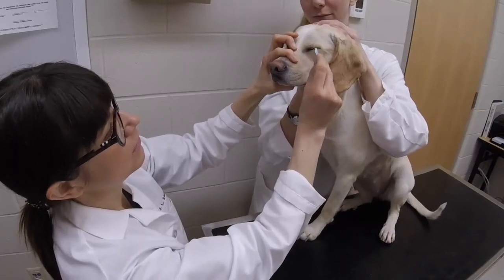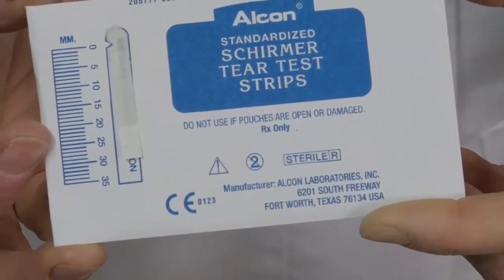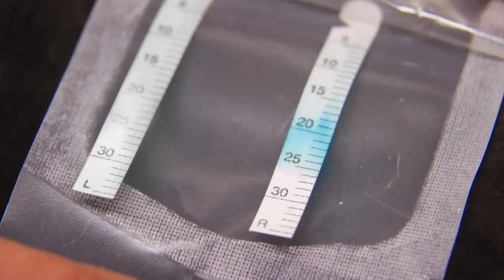After 60 seconds, the strip is removed and immediately placed on the measuring gauge provided on the original package to measure the amount of wetting in millimeters. Schirmer tear test strips are also available that are impregnated with a blue dye that marks tear migration in millimeters directly on the strip.